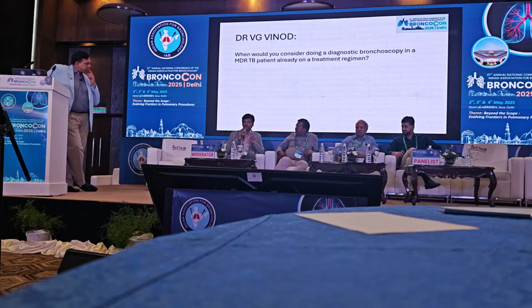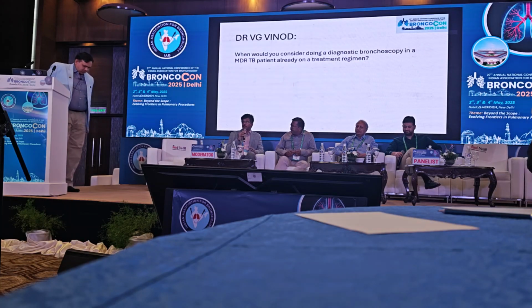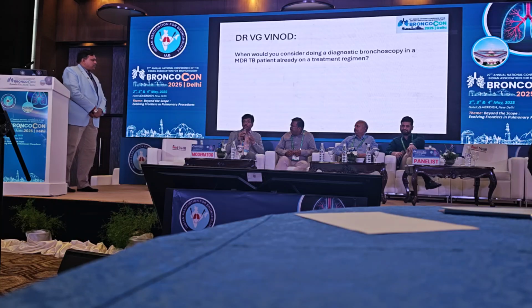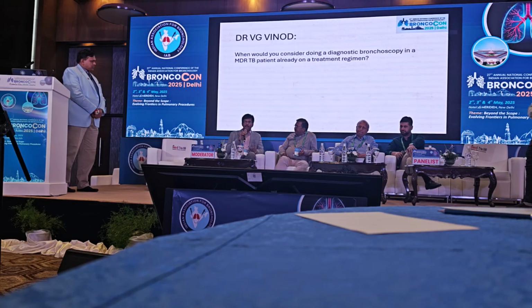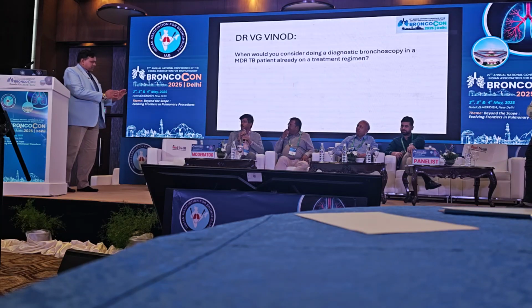Recently I had encountered a patient whose diagnosis was sputum positive MDR TB in a background of silicosis. In that patient there were no other risk factors for MDR TB. So again the thinking was whether it's really a valid sampling technique, or is there an error in the sample. So we went ahead and did a bronchoscopy lavage, and it turned out to be GeneXpert sensitive. So we changed the diagnosis, and pending further samples like LPA and other things, we put him on a drug sensitive TB regimen again. That's the first thing: if there is a suspicion that it's not MDR, it's reconfirming the diagnosis.